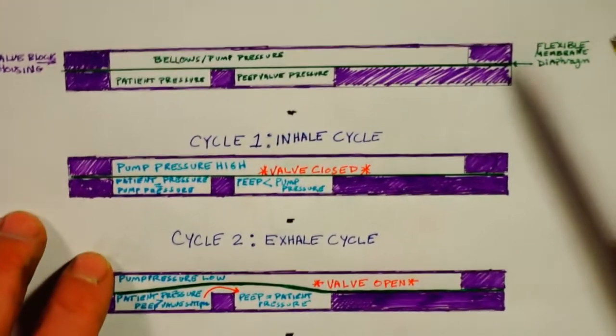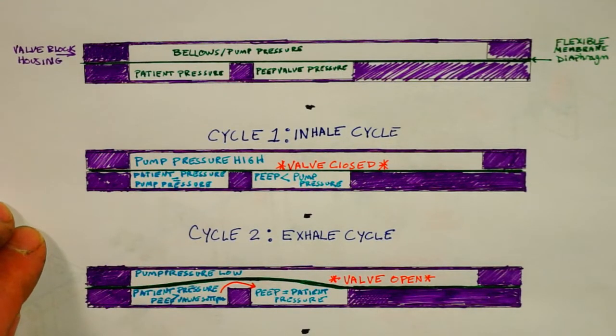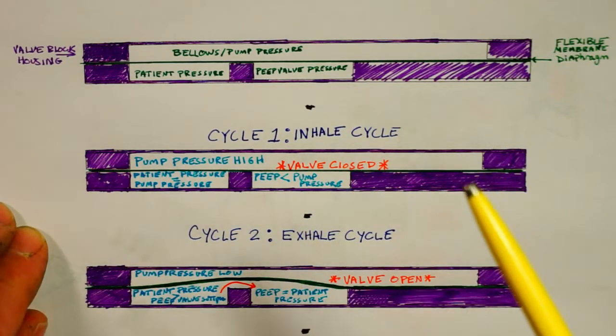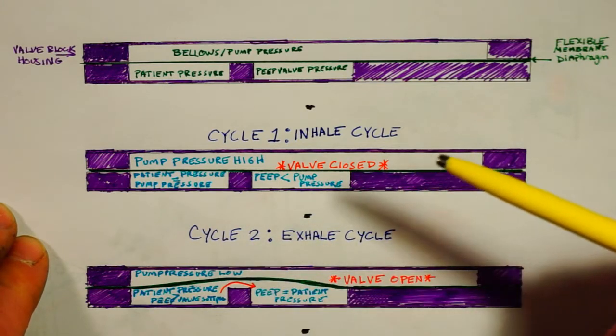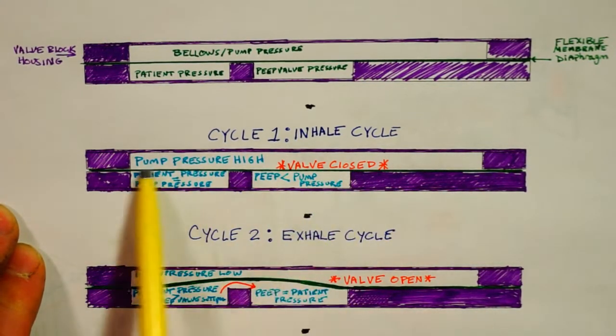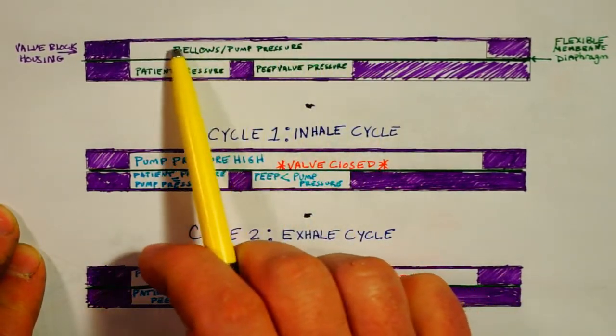And I think it's interesting that usually when we teach electrical engineering, we use fluid analogies, like a resistor is a stricture through a pipe, or a transistor is some sort of a valve. I'm going to use an electrical analogy to explain this, which is I think of this much like a transistor or a MOSFET, where this is the gate up here, right, where you can apply voltage but there's no flow.